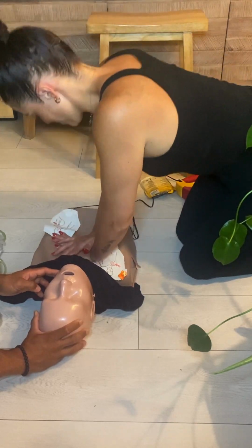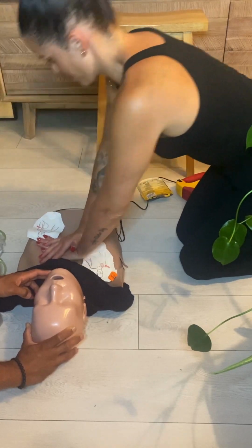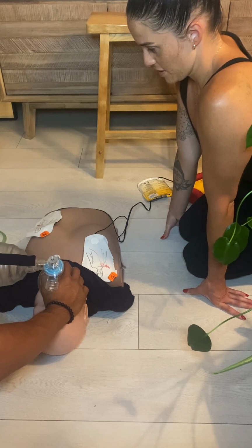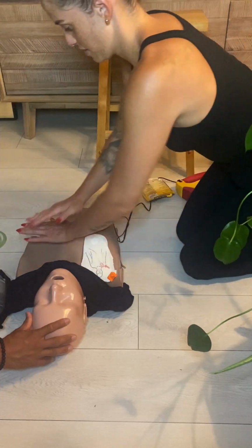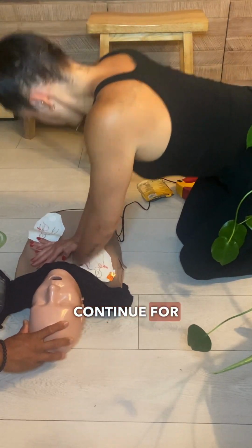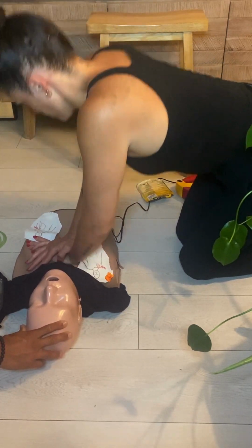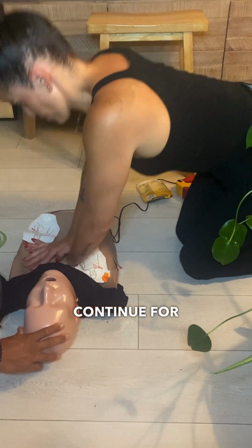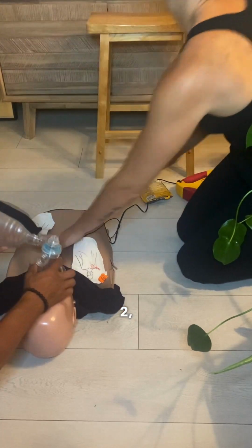Continue for 45 seconds. Continue for 30 seconds. Continue. Continue for 15 seconds. When I do the breaths, grab the remote. After this, I'm going to push 2. Continue for 5, 4, 3, 2, 1.